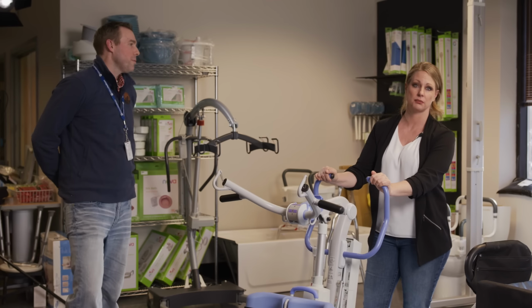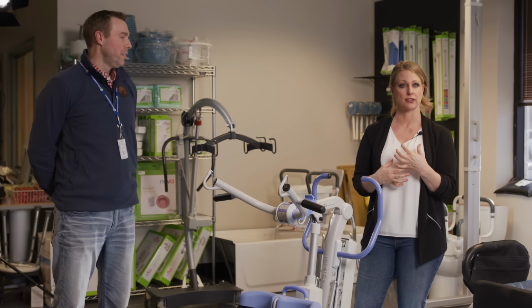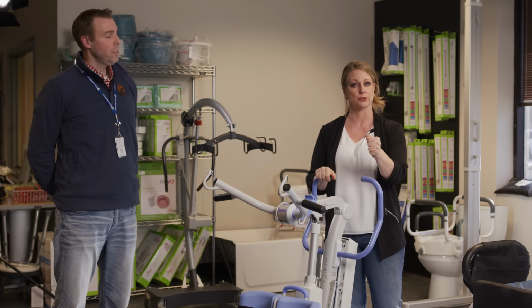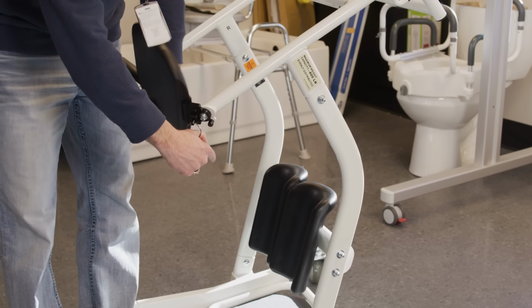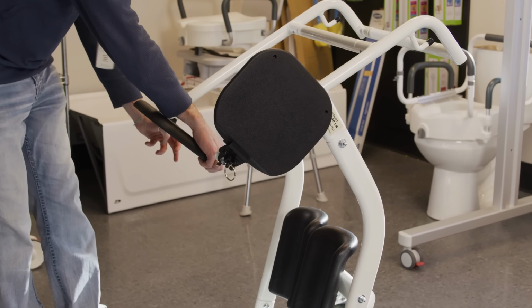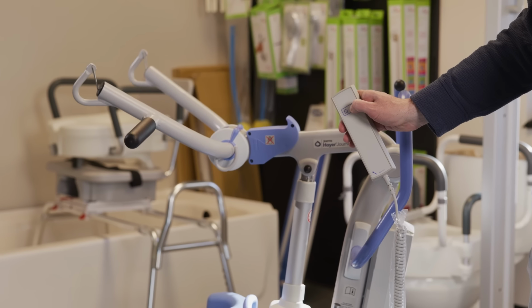Consider how many times you're going to be lifting somebody up and down and the wear and tear on the caregiver's body. So you really want to use the appropriate tools. You wouldn't use the wrong screwdriver to do a job. Don't use the wrong lift to do a job. So we've mentioned a few lifts already. We've mentioned Lumex lift, which isn't covered by insurance, would be an out-of-pocket expense. We've talked about sit-to-stands that get you upright to move you.